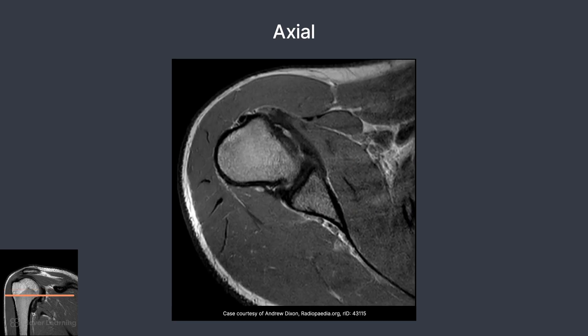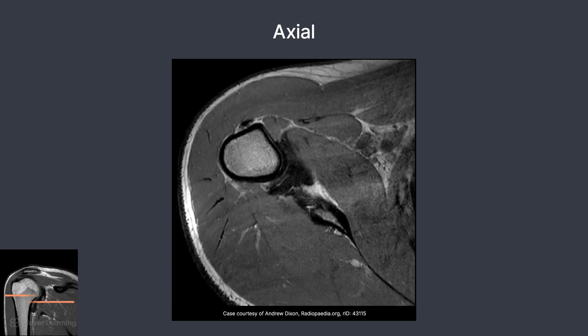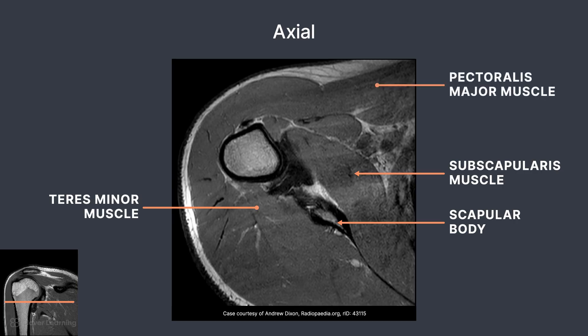Continuing inferiorly, now we can see the teres minor muscle underneath the deltoid muscle. Anteriorly, the subscapularis muscle is seen just in front of the scapula. On the final slice, the scapular body is seen with the subscapularis muscle anterior and the teres minor posterior. Toward the anterior portion of the body, the pectoralis major and minor are visible.